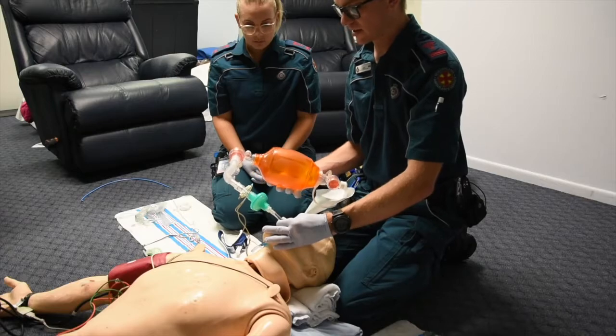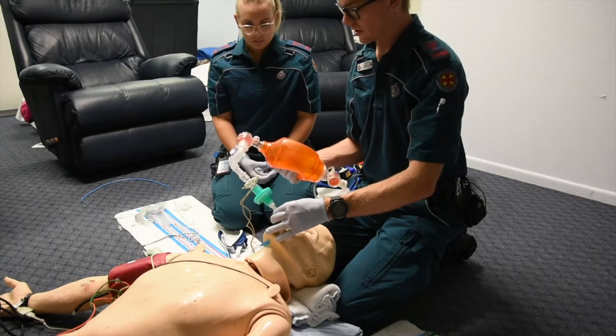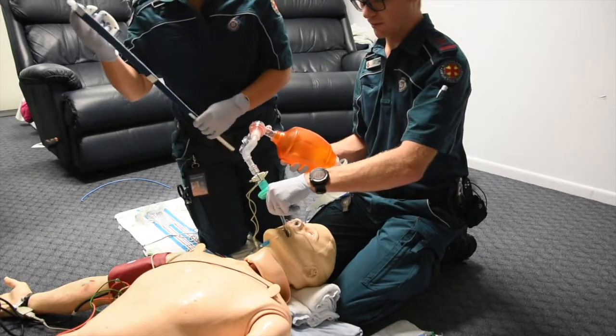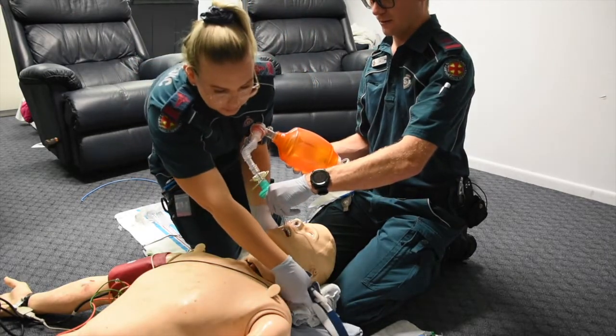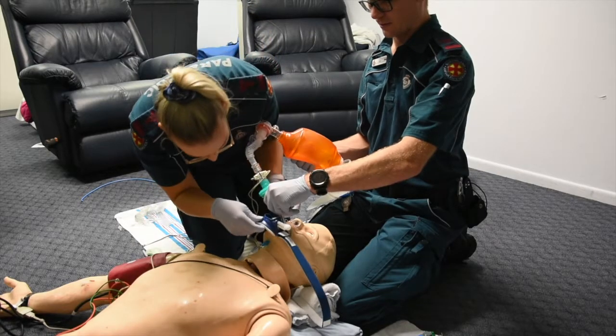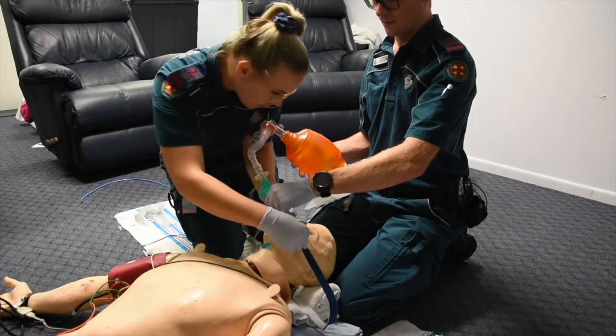So we're going to place the tube tie in, so if Chrissy wants to place the tube tie in, please. So I'm going to hold on to the bougie, the tube up high. Do this. There we go.